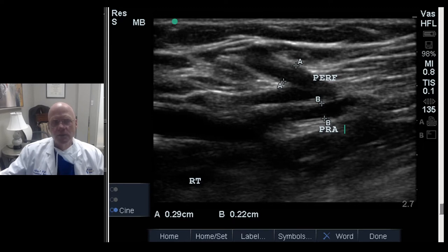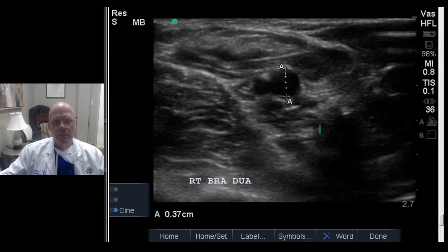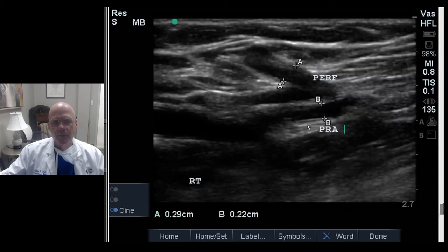And the reason is we want to have at least 2 centimeters from this dot to the crossing point. And let me see if I can show you that. You can measure this ahead of time when you do it, like I'm doing. So that's 2.5. So you can see if you enter the perforating vein where you can see it in continuity, you're kind of short-sighting yourself with less than 1.5 centimeters between your access site in the vein and your crossing point. So we like to have a little more distance than that.